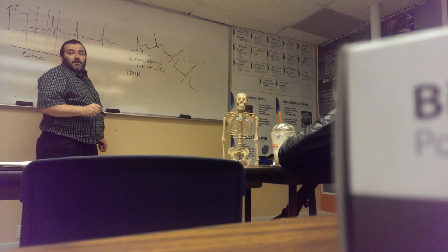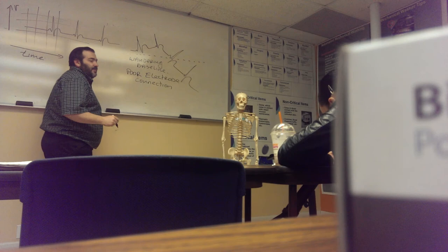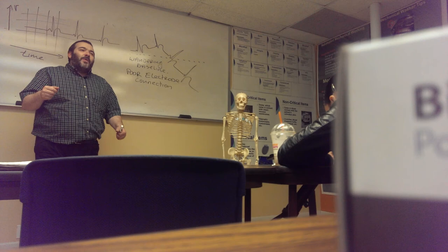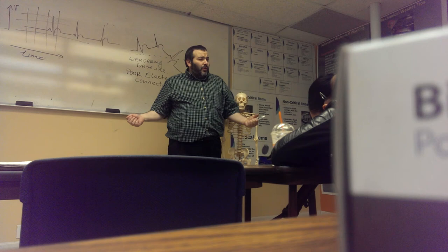Poor electrode connection. So your stickies are pulling off. Somewhere along the way, you didn't glue them correctly, or the wires are pulling on them and there's a bad connection, or the person has sweated during the procedure and they just unglued. You will get a wandering baseline. So what are you going to do to fix that? You're going to check and make sure that all the connections are tight. You're going to fix your wires so they're not pulling on the tabs. Okay? Fix the wandering baseline.